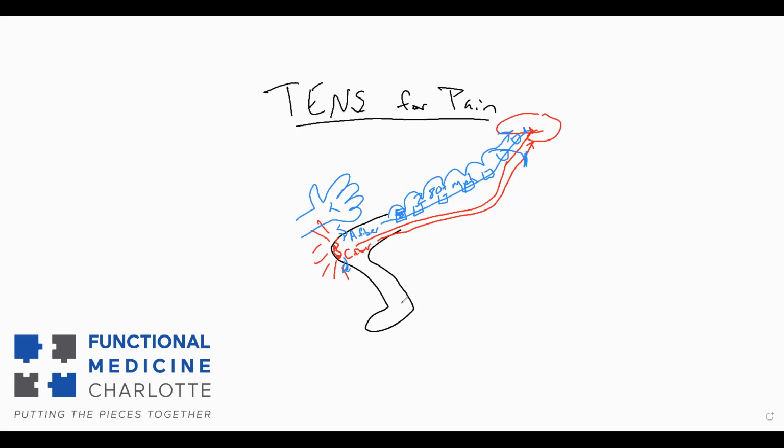Okay. Thank you. You just have to play with it on your own with the settings and say, okay, how high can I go, and do I like it, or is this too high? So start at 0 and turn it up slowly until you get to that happy medium of like, hey, the muscle's bouncing and I can handle it.